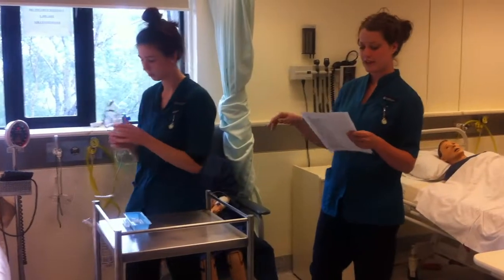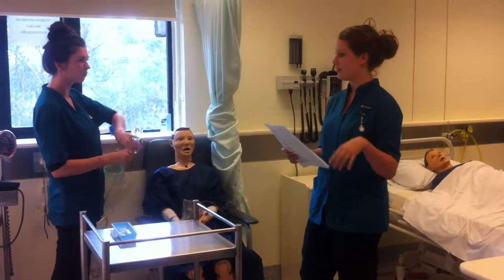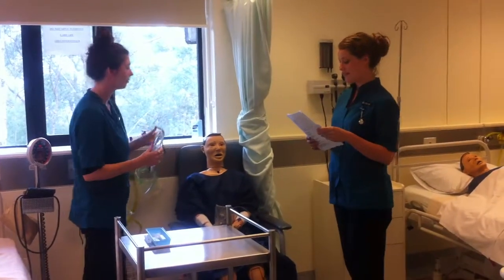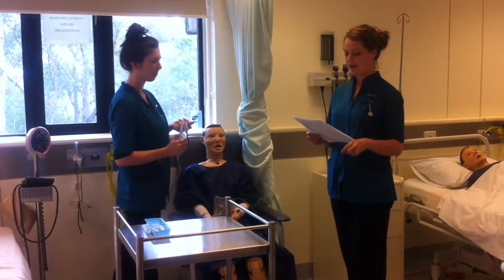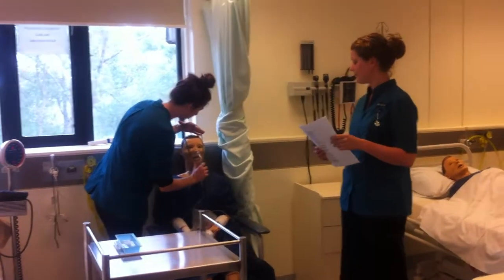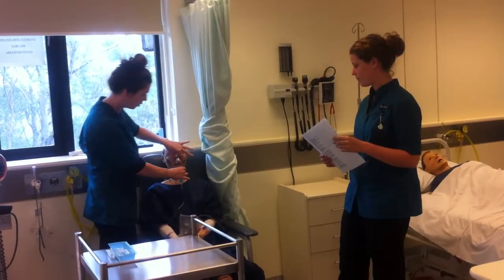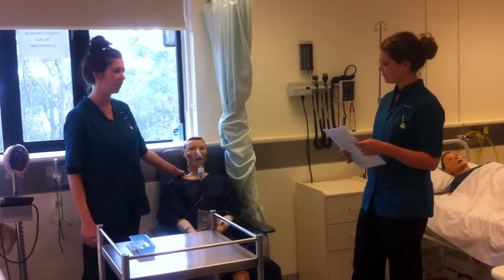Before Penny put all the drugs in, we checked that it was all okay and there were no dust particles that were drawn into the nebulizer. Penny will ensure that the patient is in an upright position and that the nebulizer is upright on the face. This is to maximise lung expansion and drug delivery. Mr. Saunders, I'm just going to pop this over your head. Just make sure it's tightly around the nose and the mouth to ensure no air escapes. And he's sitting in an upright position.